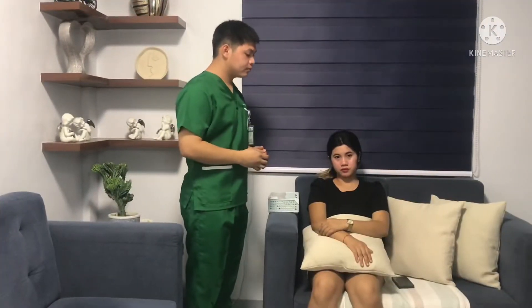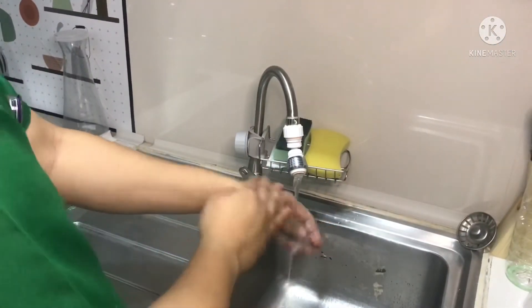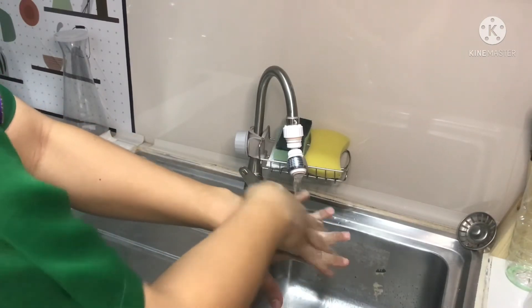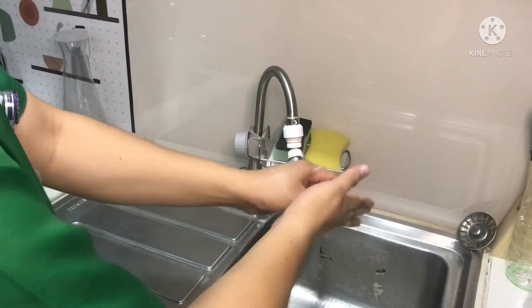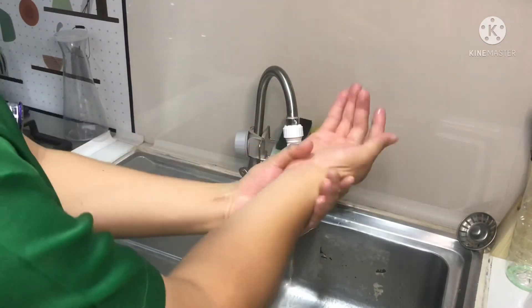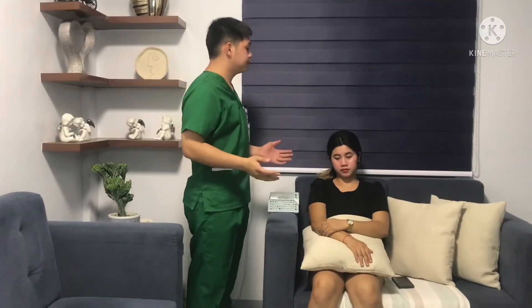Before the procedure, perform safety steps. Perform hand hygiene to prevent the spread of microorganisms, and check the room for transmission-based precautions. Introduce yourself, your role, the purpose of your visit, and an estimate of the time it will take.